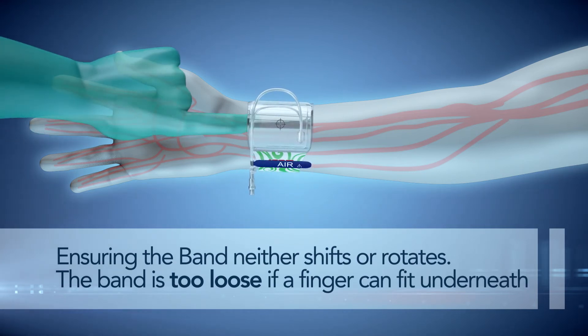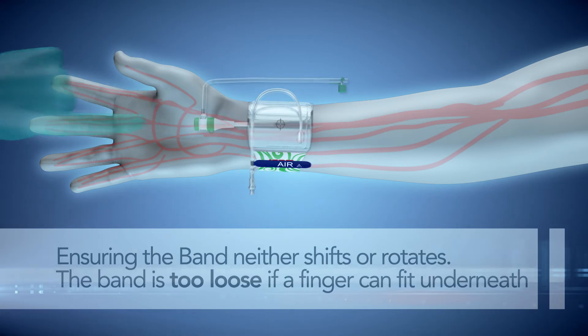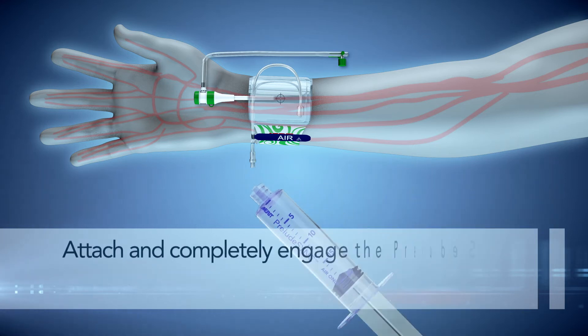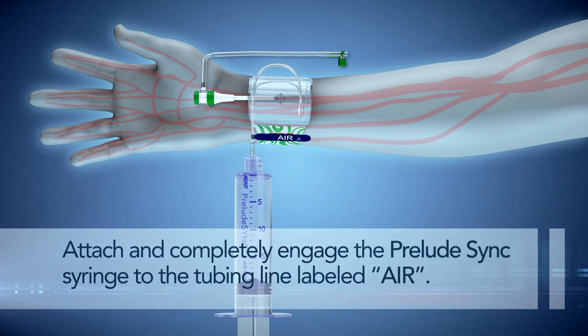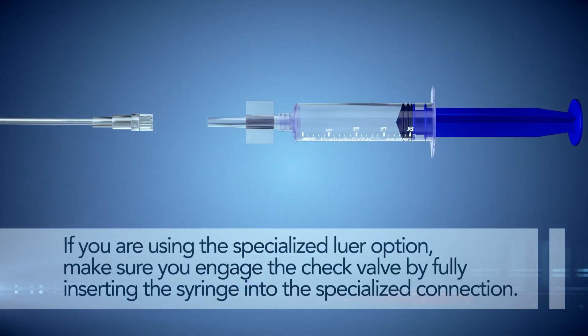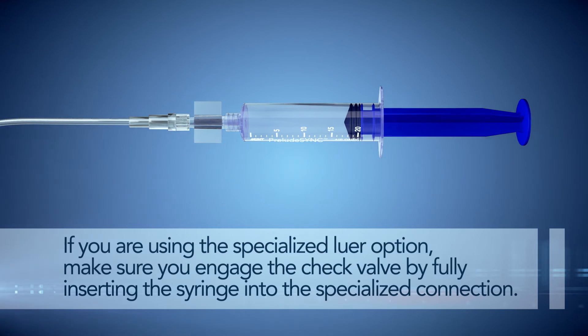The band is too loose if a finger can fit underneath. Step 3. Fill the Prelude Sync syringe included with the band with 20 milliliters of air. Attach and completely engage the Prelude Sync syringe to the tubing line labeled air. If you are using the specialized luer option, make sure you engage the check valve by fully inserting the syringe into the specialized connection.